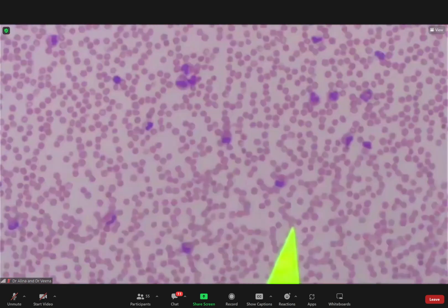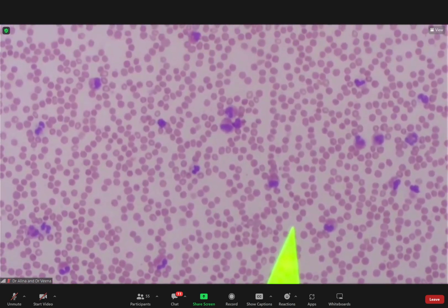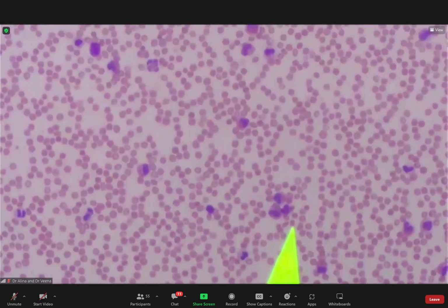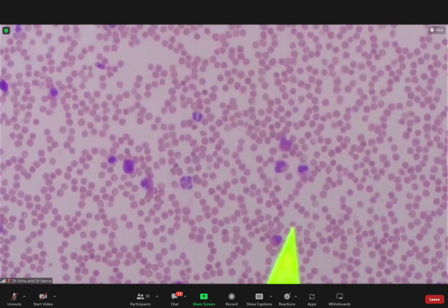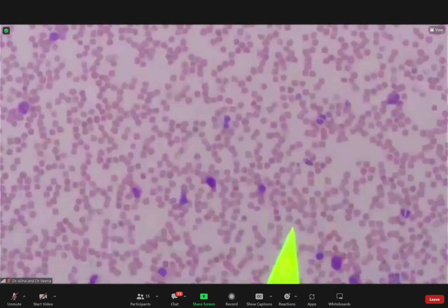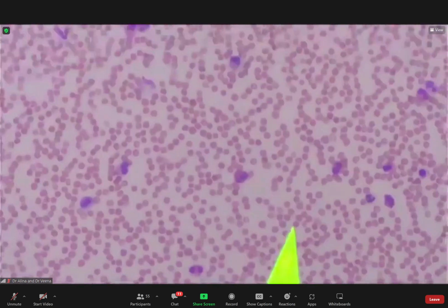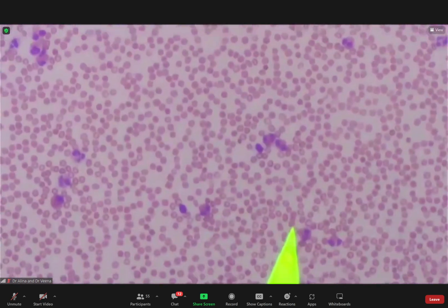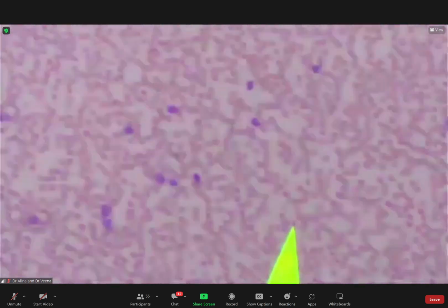Eosinophil? Eosinophil? So patient obviously has eosinophilia. Right? Lots and lots of eosinophils.